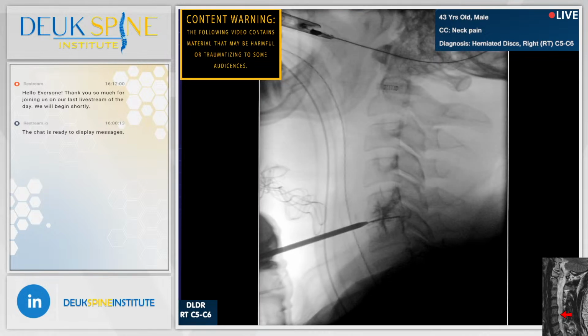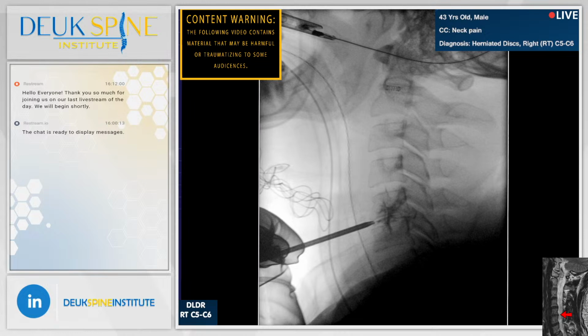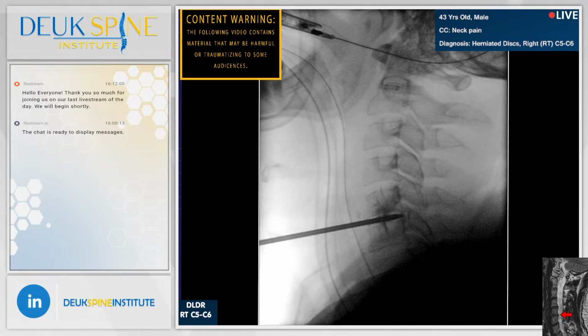All right, now we're going to advance the dilator through the anterior longitudinal ligament, or ALL. That's it? Good. Here we go. We're going to pass through the disc. Remember, the disc is fibrous. It has fibers, sorry, not muscle fibers, but annulus fibers, or what are called connective tissue fibers. And we're literally spreading the fibers apart.